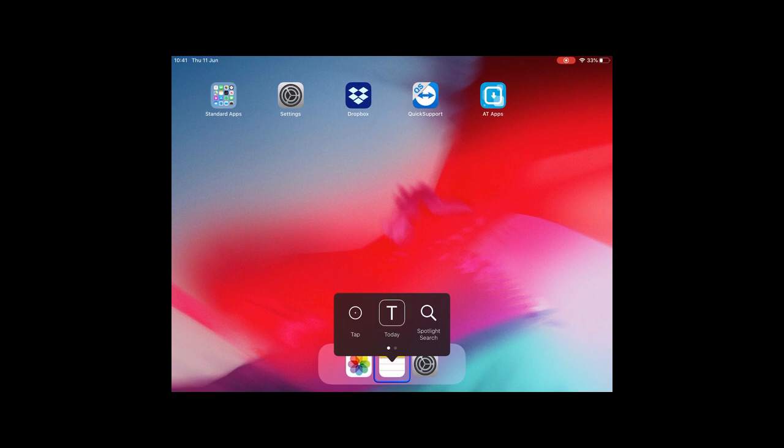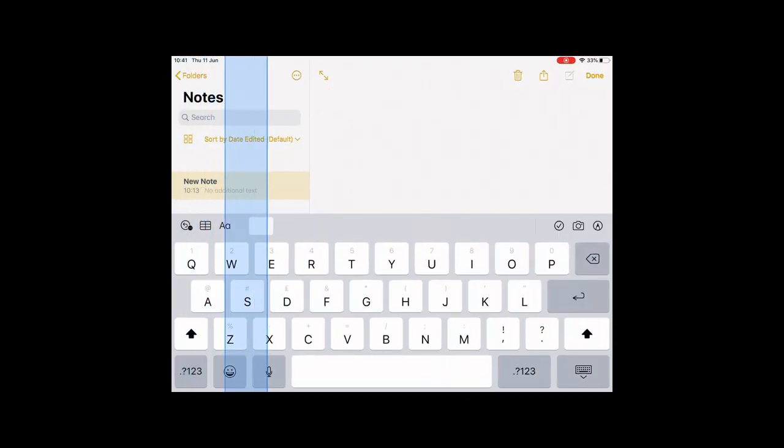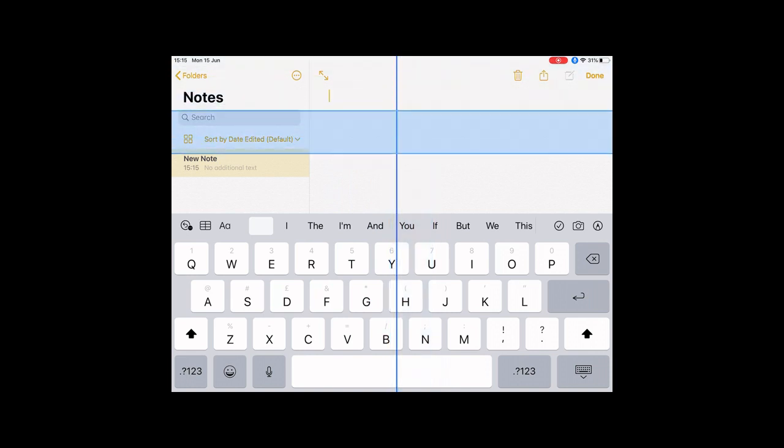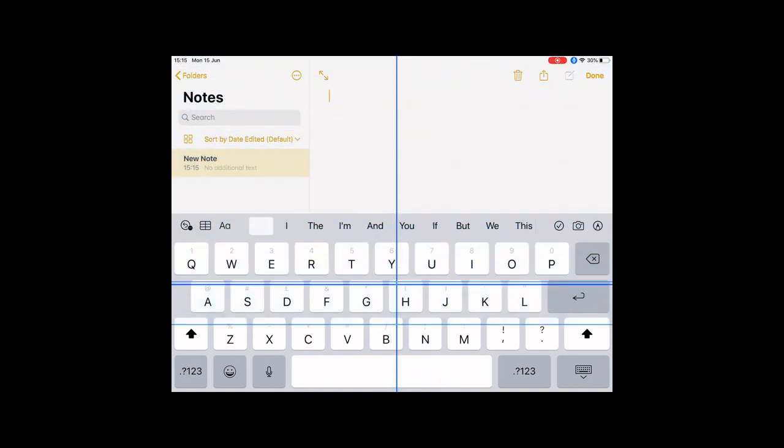That then brings up the scanning menu, as we've seen before. And what we need to do is highlight Tap and then press the switch. And now I've opened Notes. So I'm going to demonstrate that again. Using the gliding cursor, we're going to type out the word hello.